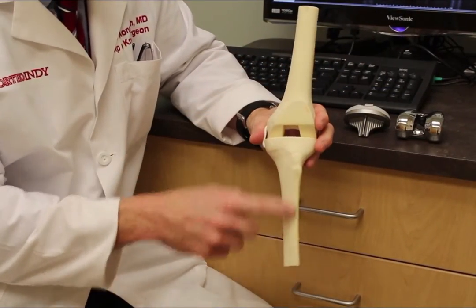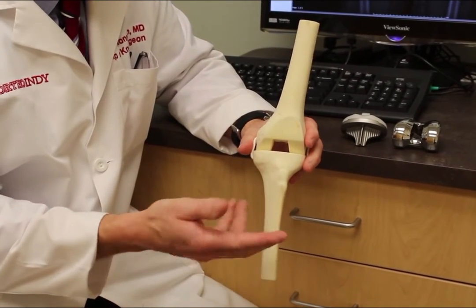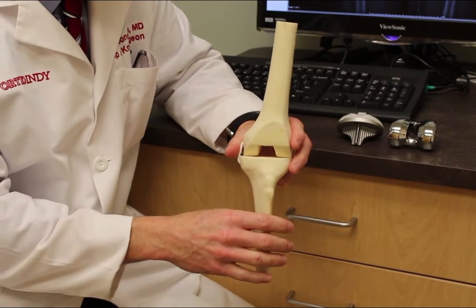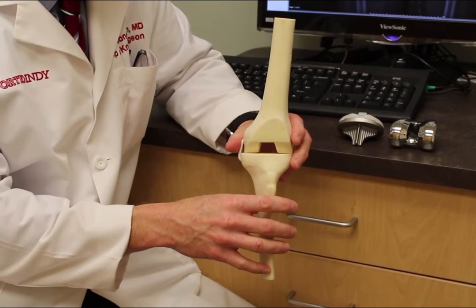This represents your thigh bone, this is your shin bone. Most people, when they hear the words total knee replacement, think that we're going to take large cuts of bone — but that actually is not the case. What we really do in a total knee replacement is resurface the ends of the bones.